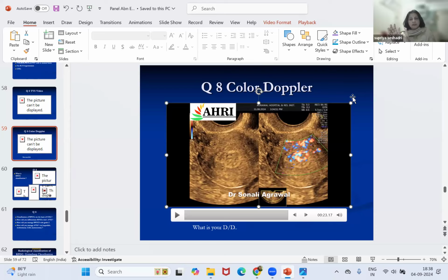If the endometrial vascularity is more than that of the myometrium, it is type 3, and there's a type 4 as well, I forgot. So type 0 is most likely non-RPOC, it's a blood clot. Even if it's a blood clot or an avascular RPOC, I would think, from whatever little years I've spent as a clinician, there is really nothing to do because that will get expelled.